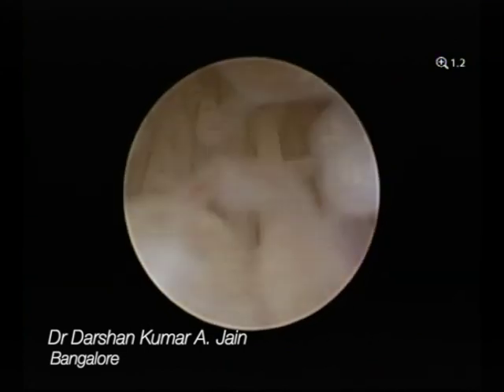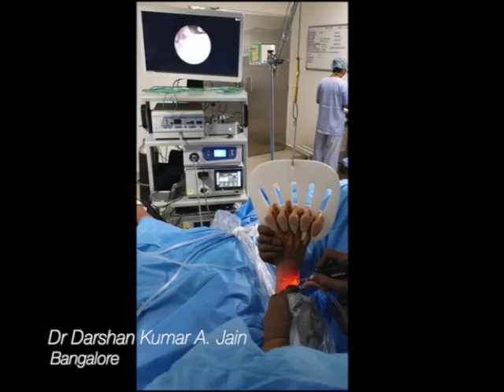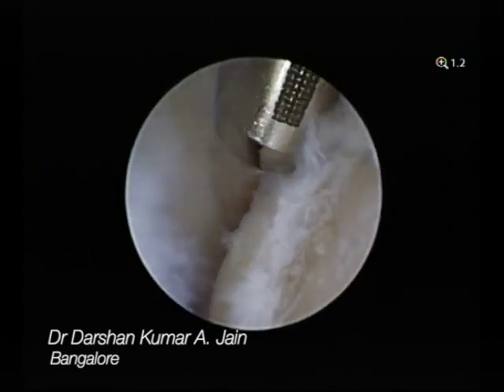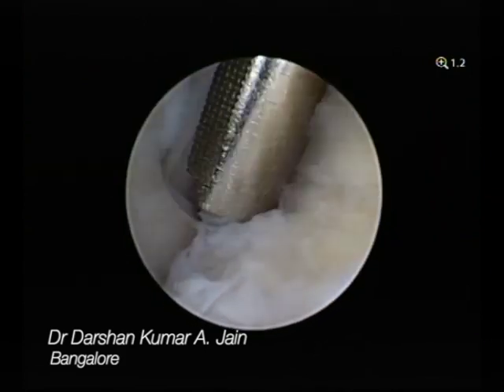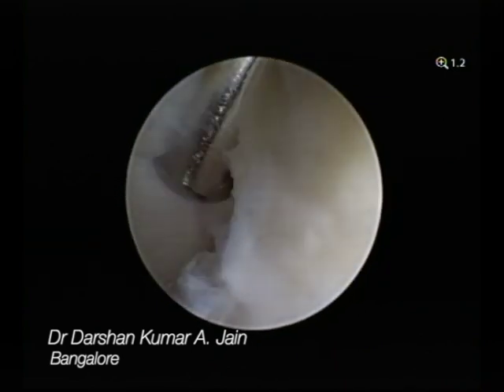This is the extensive synovitis you can see. This is the volar sac. When you push your scope slightly inside you can see the extensive synovitis throughout. Working through the other portal, the portals can be interchanged as well. Once you clear off, you can see the small erosions, whereas the sigmoid notch is quite good. You clear off all the synovium.